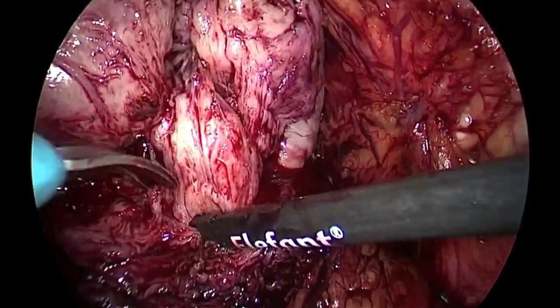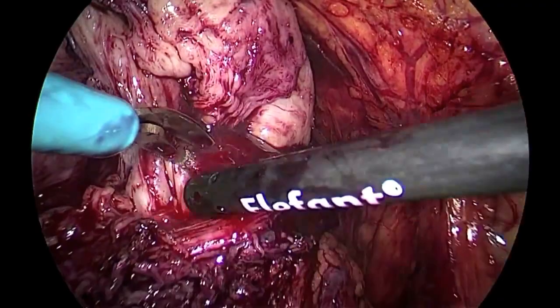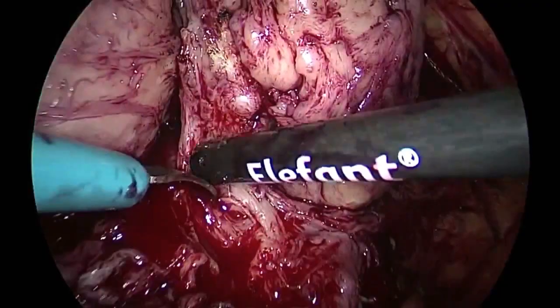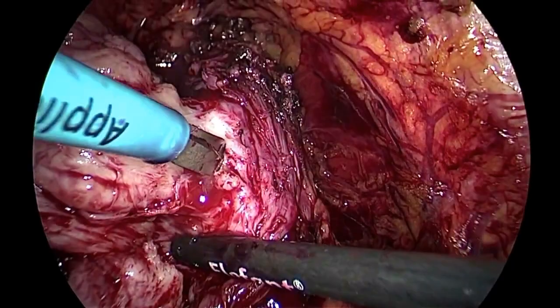Okay, coagulation. So it's important, obviously, to find very well the plane between the capsula and the adenoma.